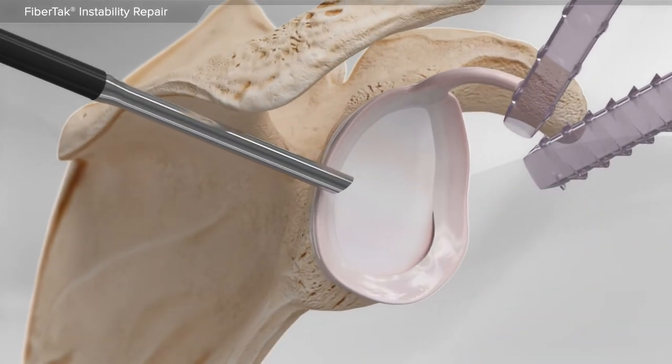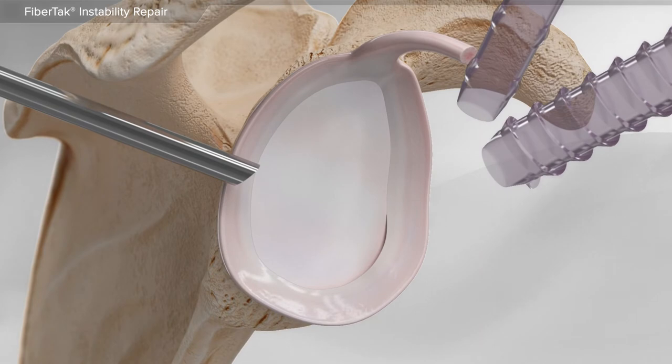In this animation, we will show the repair of the labrum in the shoulder using the fiber tack anchor. The glenohumeral joint, or ball and socket joint, is responsible for the majority of movement in the shoulder.